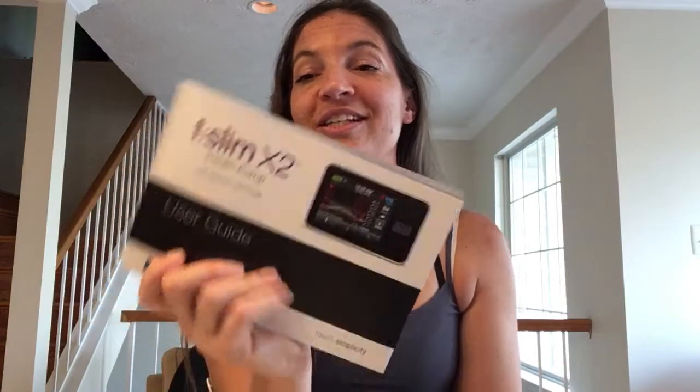There is real information in your user guide, and you can always pick up the phone and call Tandem and just say, 'Hey, I'm trying to get this thing set up, what do I do?' I don't think they're going to leave you hanging. In the meantime, I'll try to show you around my own pump as I get my own set up today.